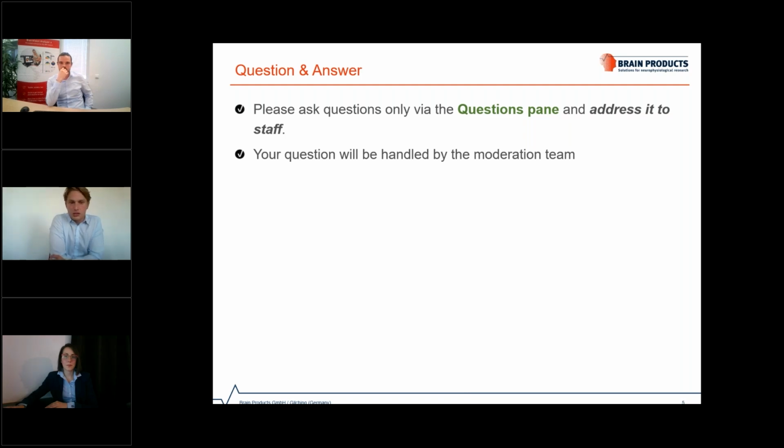So the answer is no. They do not possess an FDA marking or a CE medical marking. So they cannot be used for diagnosis or treatment of medical conditions, but this is not our focus. You can use it for clinical research, of course, but not for medical application, let's say.